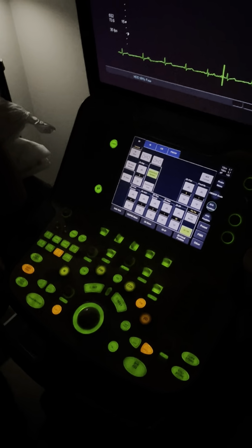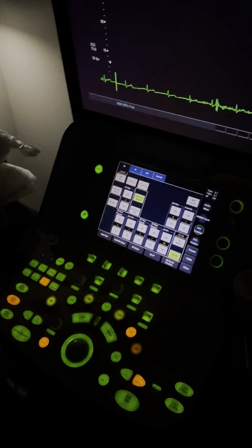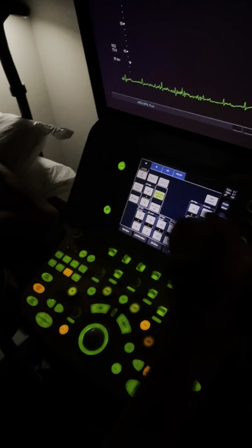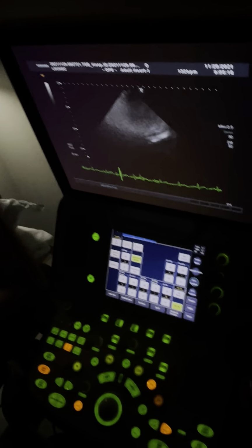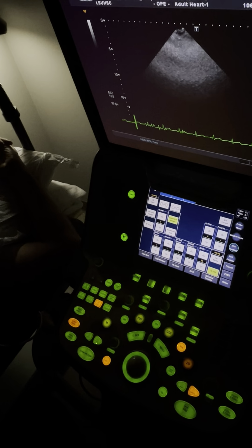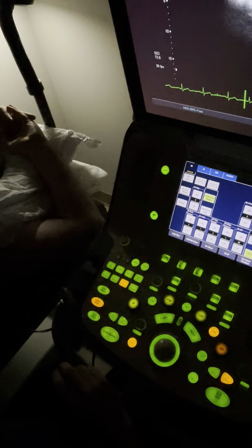All right, now we're going to have our patient roll back on their back. Bend your knees. Now, just so y'all know, I'm not standing up because y'all are taping, but I typically do this particular view standing up. It's just easier on my shoulder.